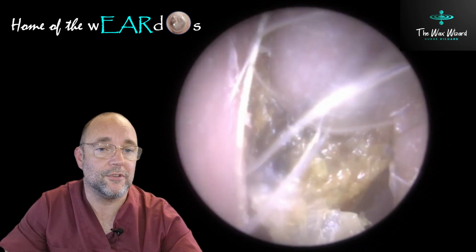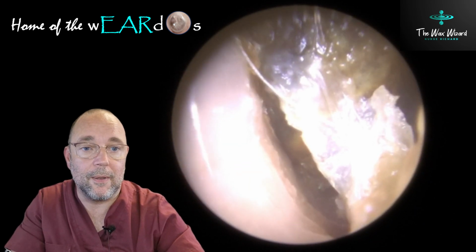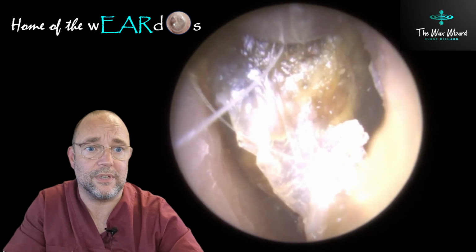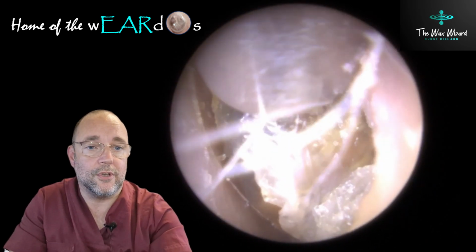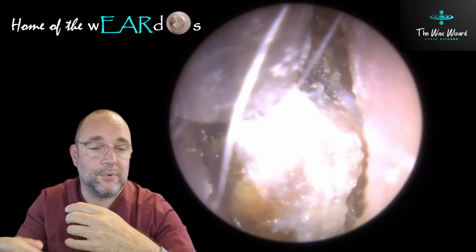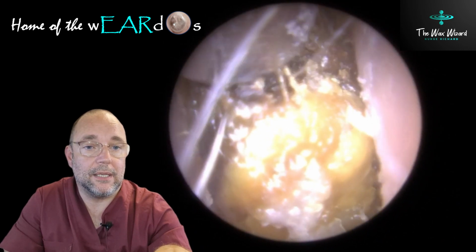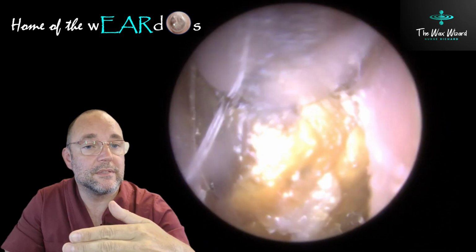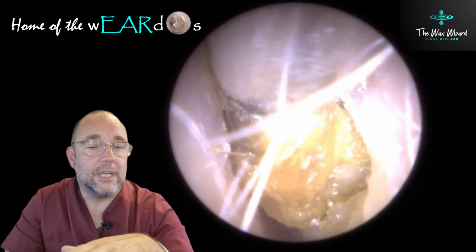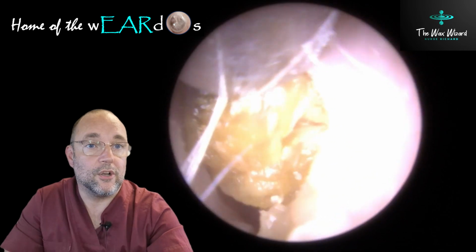It was really difficult. I don't know if you just saw it. I came away then. This is why this one's interesting, because it's triggered a cough reflex. Now, why does it do that? A few of you regulars who've watched other channels for a while may well be aware of this. It's called the Arnold's Reflex. Now, what's the Arnold's Reflex? The Arnold's nerve is a branch of the vagus nerve which runs alongside the ear, and it provides sensory information from the outer ear. Now, when you've got something like this, again, it's a really small ear canal and ear entrance. So as I'm pulling this relatively big chunk out, it's put some slight pressure on the ear canal, and it's triggered that nerve that runs along the ear canal, and that's triggered a cough reflex.